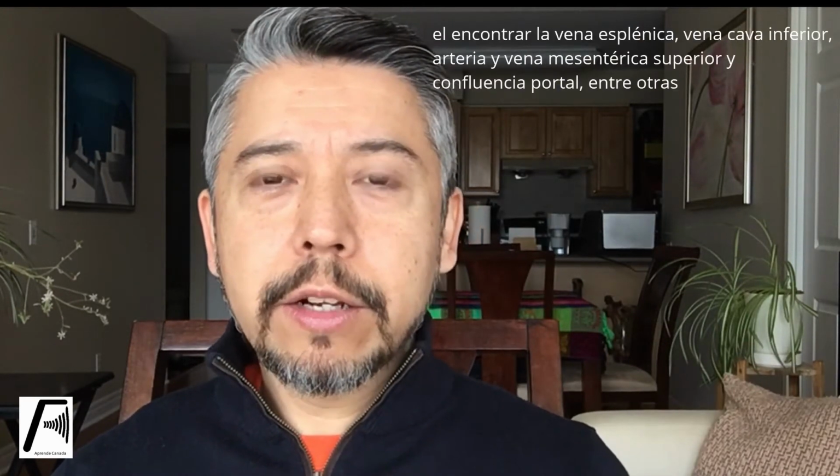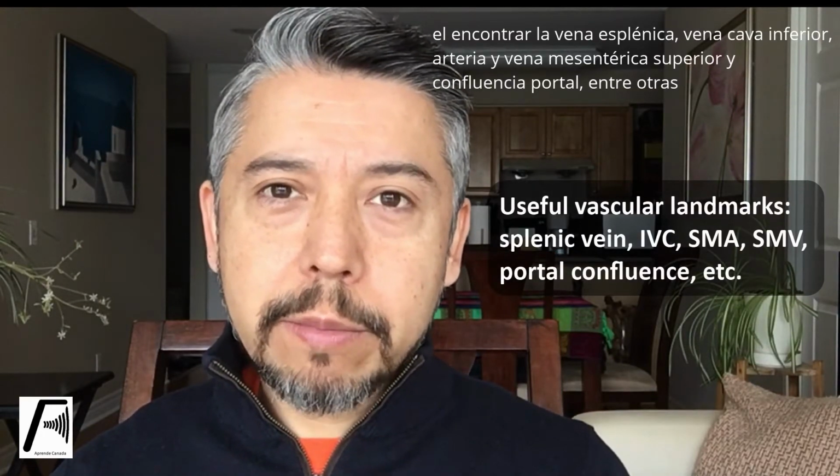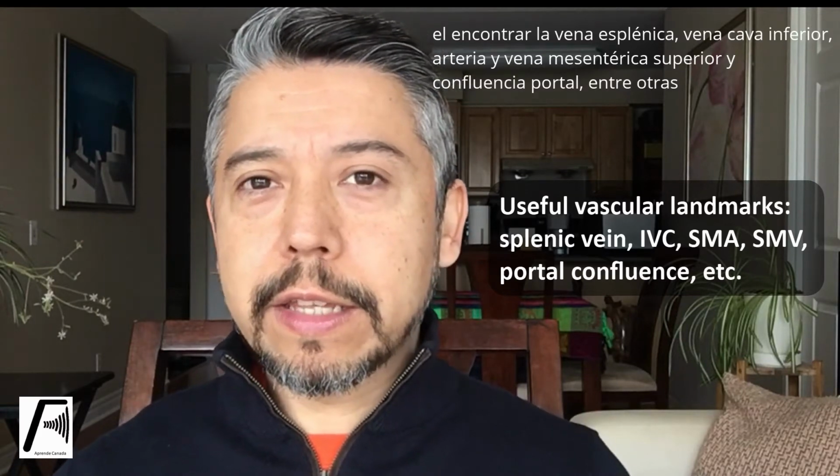With time, of course, you get better at it, and then it becomes more automatic, looking for the splenic vein, looking for the IVC, for the SMA, for the SMV, for the portal confluence, and things like that.